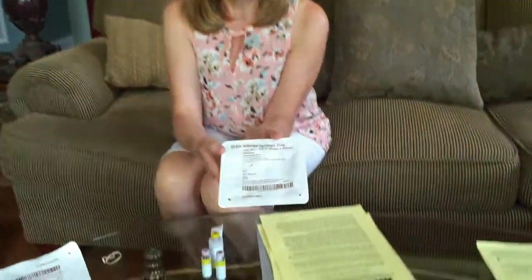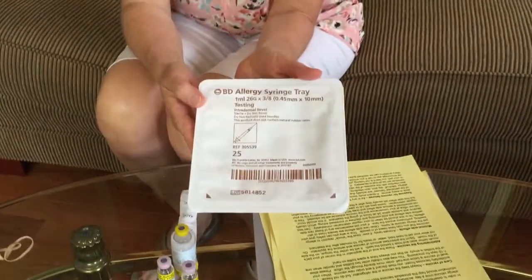Hi, your pet has been diagnosed with allergies and is going to be getting a custom-made allergy vaccine. So when you leave here today, you are going to go home with some items. You're going to go home with a tray of syringes. There are 25 in here, and when you need more, you can get them through our office.